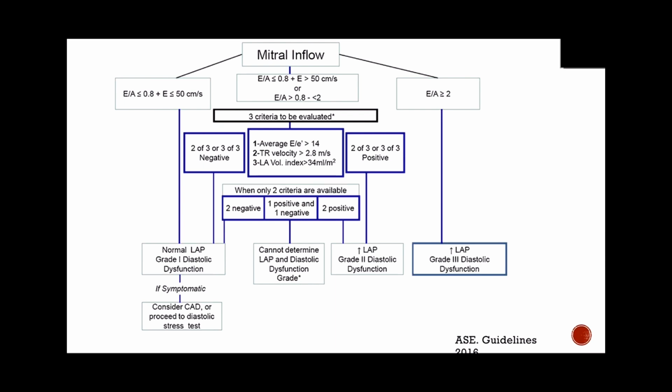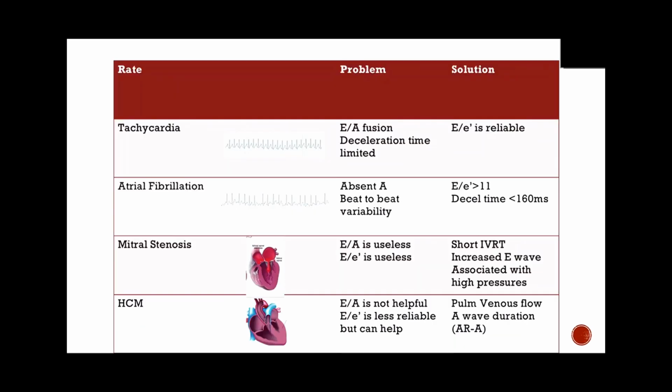Now, I don't calculate left atrial volume at the bedside, but you can do that, and you can do it in a very similar way that you look at volume within the left ventricle during systolic function that was talked about last week. So again, we're not going to go over this in general, just for the sake of time, but this is readily available on the internet, and so before you take your boards, I encourage you to take a look at this, and we're going to go over a couple in our questions.